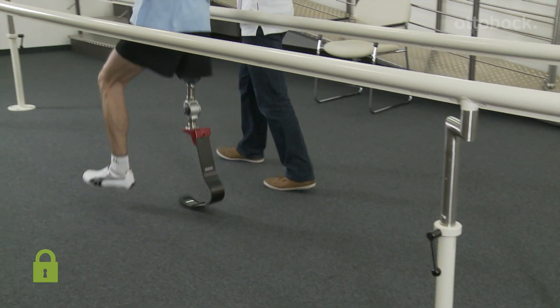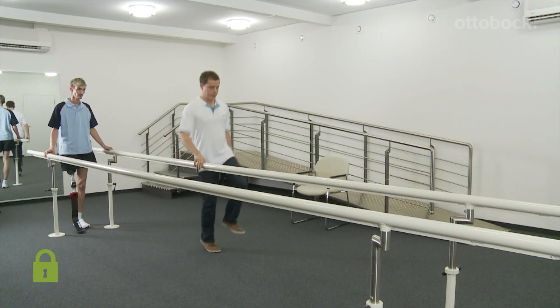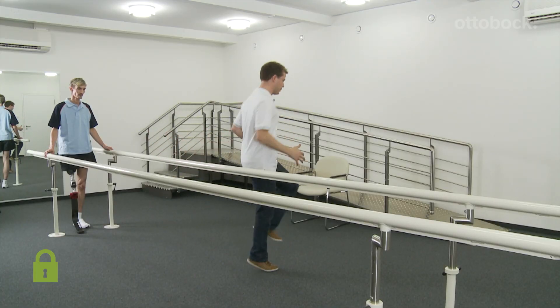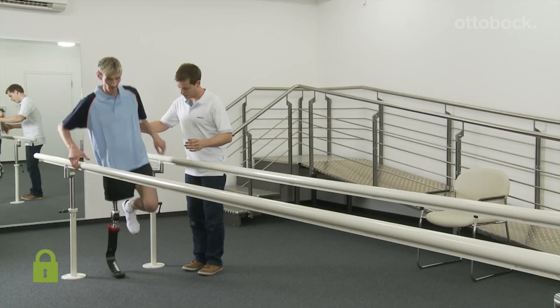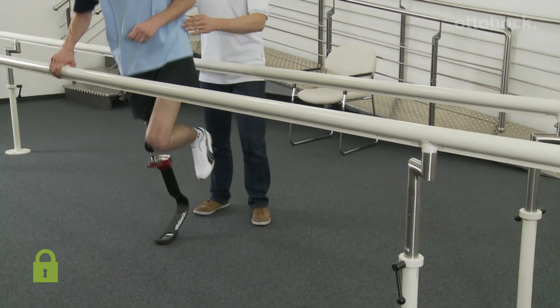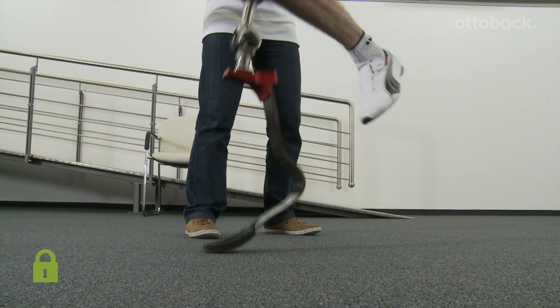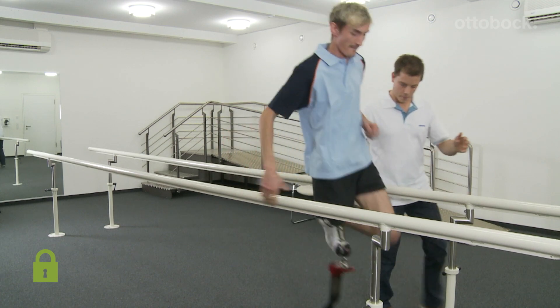As a general rule, the user controls the prosthesis, not the other way around. The next exercise serves to improve the control of the prosthesis. The user jumps forwards on the prosthesis side and, at a specified point, rotates around his axis in a jumping motion and then continues his forward motion. A sufficient support possibility is important for this exercise.